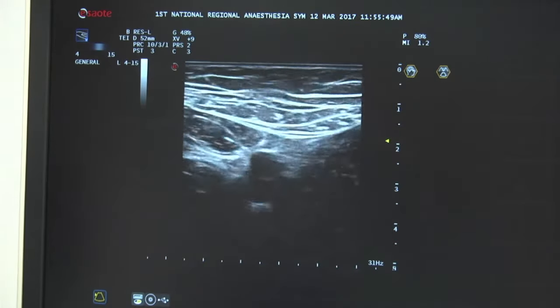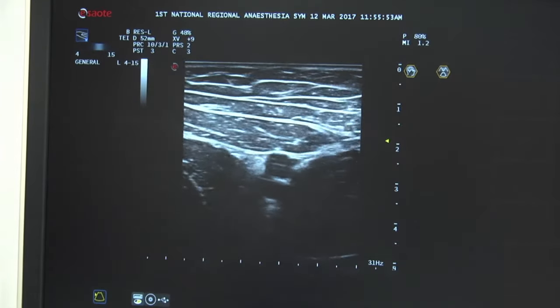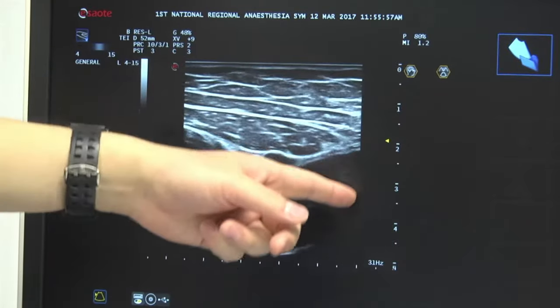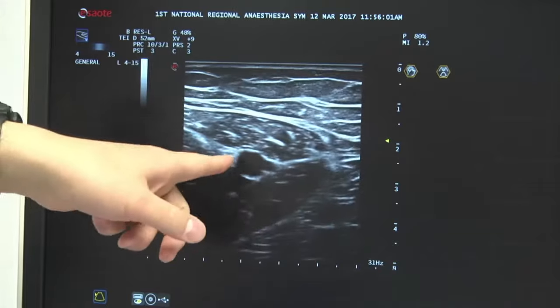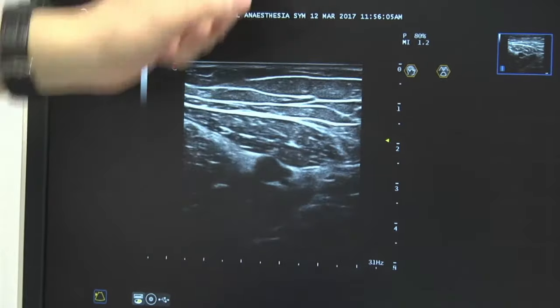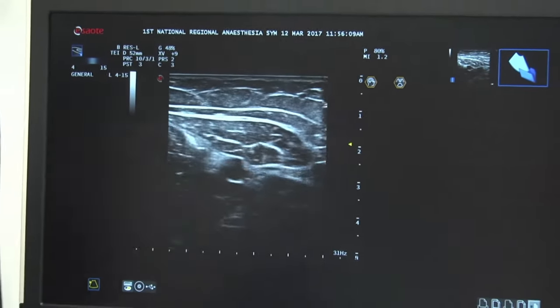Going down with the artery. Sartorius is coming in. Yeah, here's the right place, because the artery is now located at the midpoint of the sartorius muscle. You need to locate it for this? Ah, so the same question.